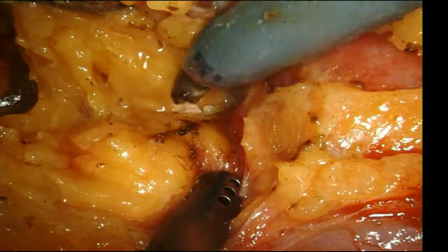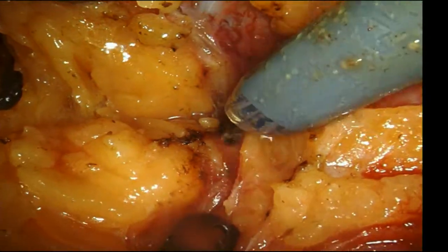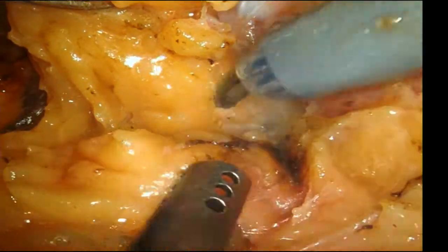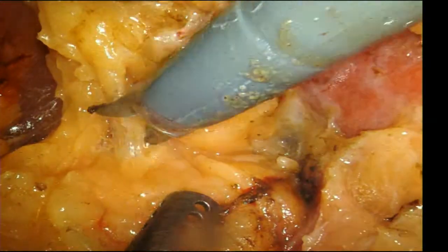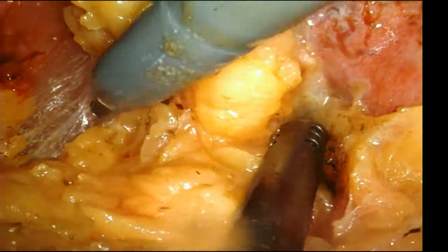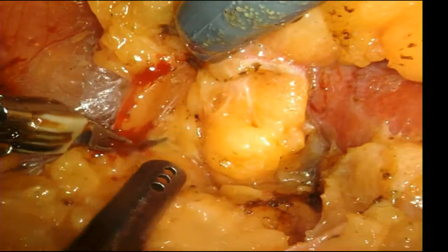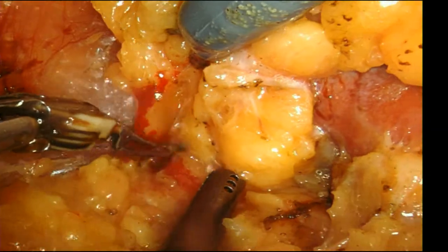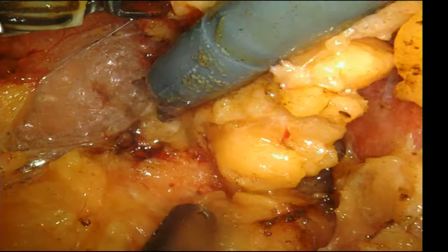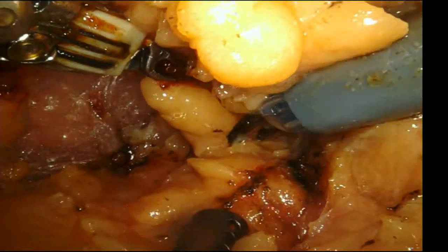So that we don't bother you too much while you're doing your resection of the tumor, what do you have on your back table now, like your essentials, if we may ask? Essentials. Like your go-to stitches and a laparoscopic Satinsky clamp, things like that. Yeah, I don't have a laparoscopic Satinsky. I guess I don't have as much as most people have. I don't usually have a rescue stitch or anything like that. I'm probably a scofflaw in that regard.